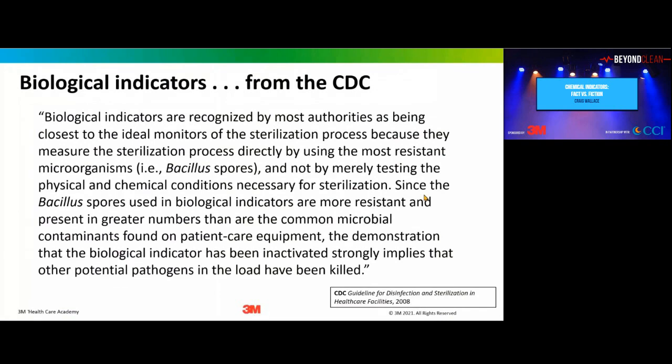The first part of it says that biological indicators are recognized by most authorities as being the closest to the ideal monitors of the sterilization process, because they measure the sterilization process directly by using the most resistant organisms, bacillus spores, and not by merely testing the physical and chemical conditions necessary for sterilization. So go back to remembering that definition that we just talked about for chemical indicators, about them having a physical and chemical response to the sterilization process.